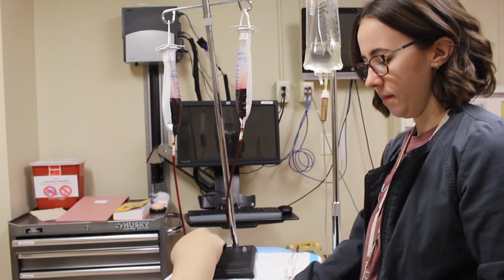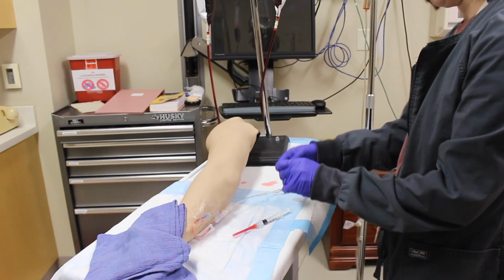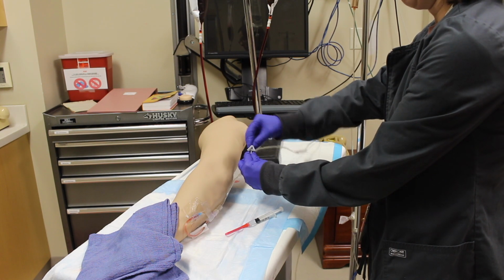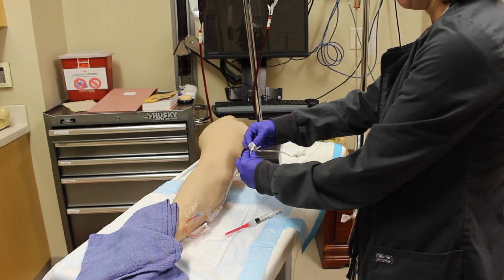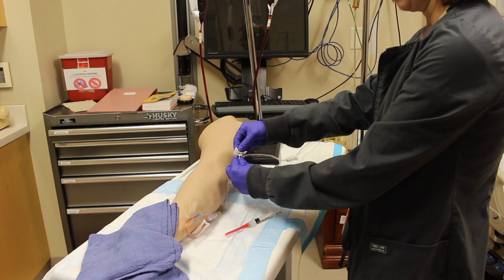Don clean procedural gloves. First, we will cover administration through a primary IV line. Scrub the surface of the injection port with alcohol according to facility policy, usually at least 15 seconds. There are typically several ports on the administration tubing set, so you will just select the one that is most appropriate for the medication that you are giving. Typically, it is the closest port to the patient.